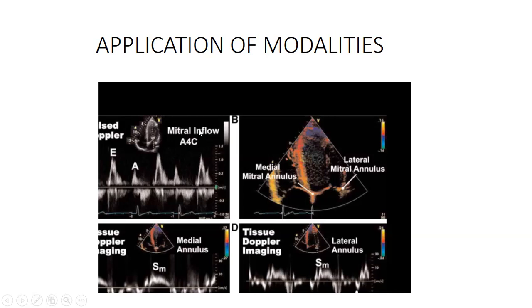So you have a line going up. You can't even see the maximum. This is the peak systolic velocity up there. You are going to see the other half coming over, enveloping or wrapping down here. Why is it coming down? Because it has reached its Nyquist limit. The Nyquist limit is just a theory which states that pulsed wave is still able to communicate that despite having picked the maximum velocity, there are still other velocities there, and it is indicative of a pathology.